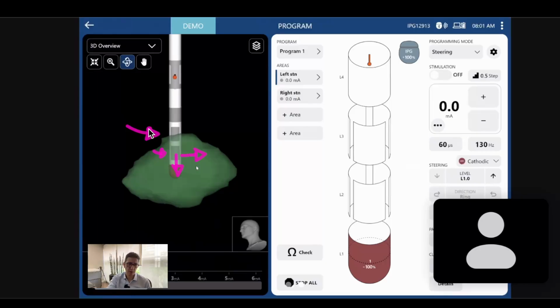So remember, when you start to program a patient, overall you choose one or two contacts, but over time, in the long term, you need more energy, and then you're going to add new contacts. You are going to call a new friend. Friend, could you help me? And then you put a new contact to stimulate this patient. You are putting together new forces.